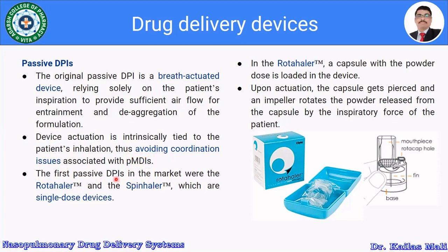The first passive DPI in the market was the Rotahaler. So this is the Rotahaler device. This is the mouthpiece. This is the Rotacap hole. Then here is the fin and base. The second one is the Spinhaler, which are single dose devices.